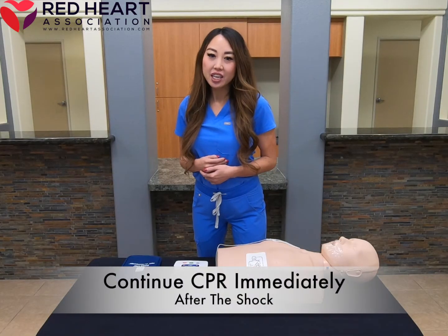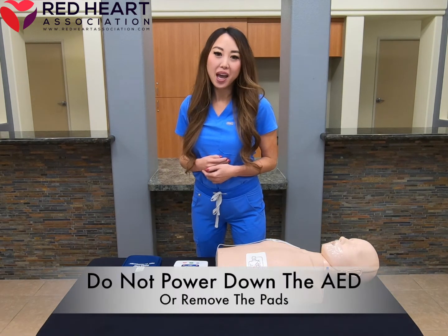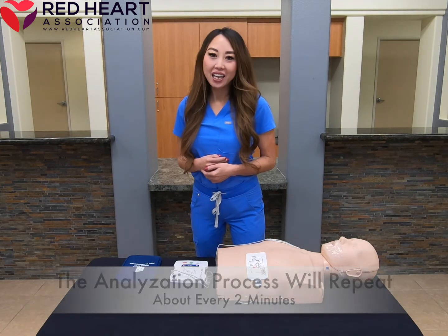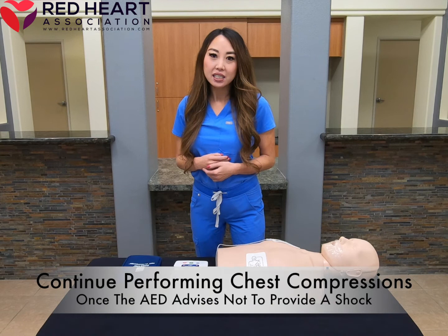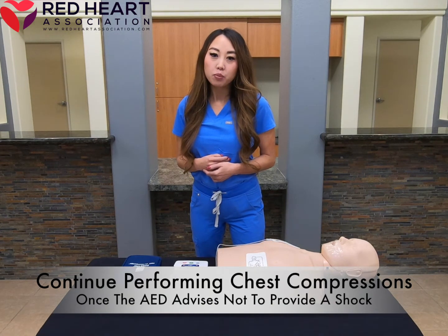After the shock, continue CPR immediately, starting with chest compressions. Do not power down the AED or remove the pads. The analysis process will repeat about every 2 minutes. Once the device advises not to provide a shock, continue performing chest compressions.